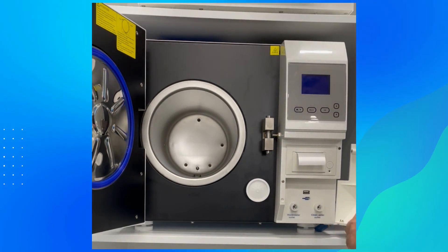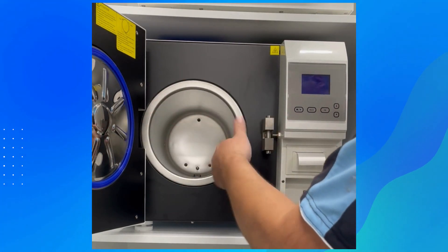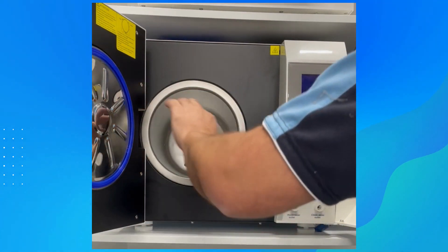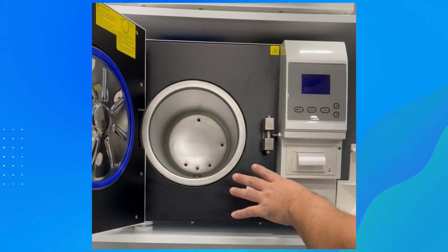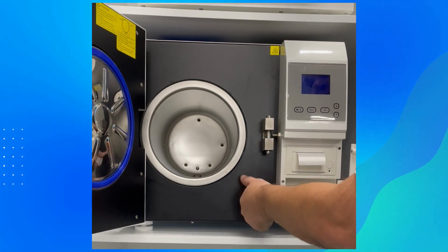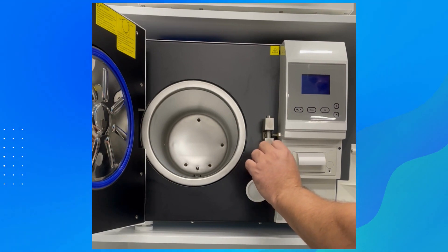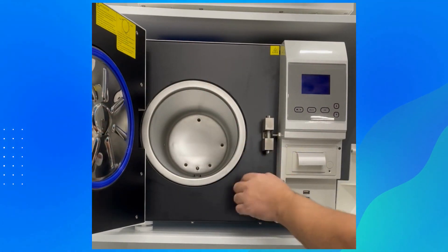Another part of maintenance, once a week or fortnight, is if you see any residue inside the chamber, get a damp cloth and wipe the inside and the door seal and around the sides. This allows the door seal to seat correctly and prevents vacuum leaks. Also, depending on your location, every three to six months change the bacterial filter — if it turns black, it needs changing immediately, as a dirty filter will affect the machine's efficiency.